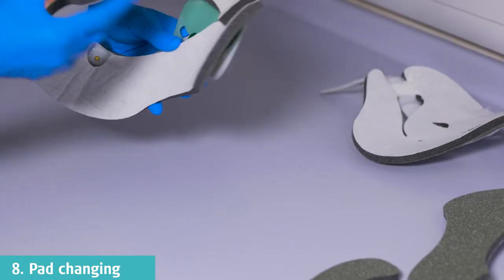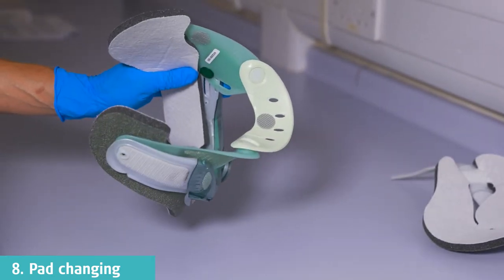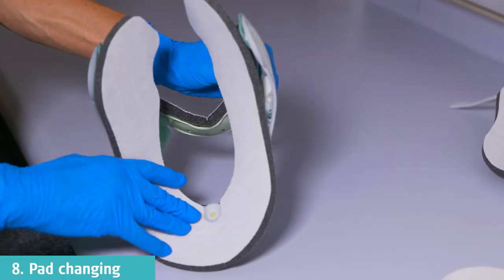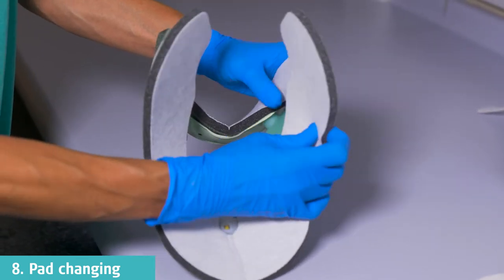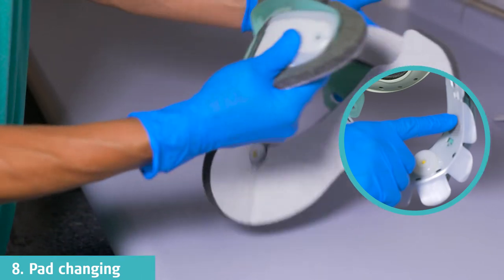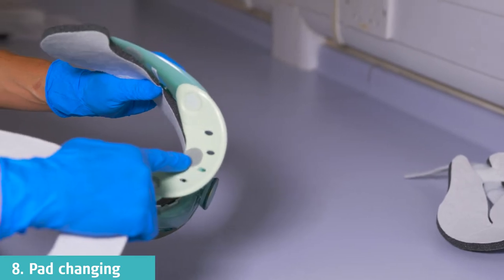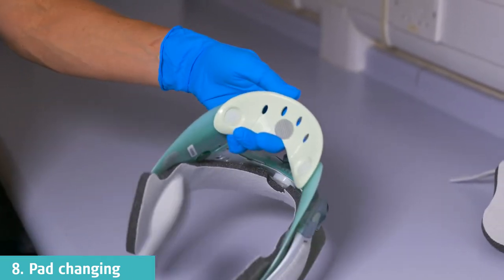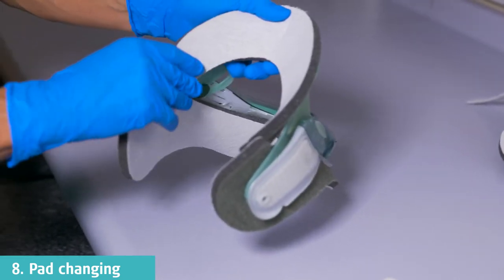To remove the pads from the front panel of the collar, lift off from the Velcro dots. To reattach the pads on the front of the collar, properly align the bottom larger pad with the corresponding Velcro dots and the plastic circle component of the collar. For the upper pad, ensure that the top piece covers the front and rear edges of the plastic components and attach to the Velcro dot on the chin piece.